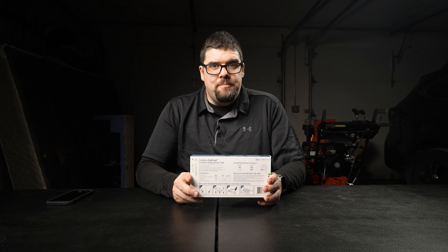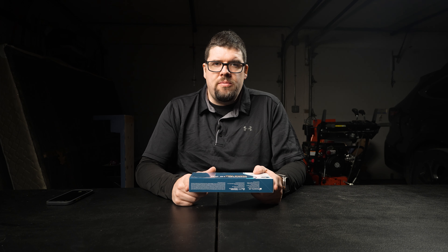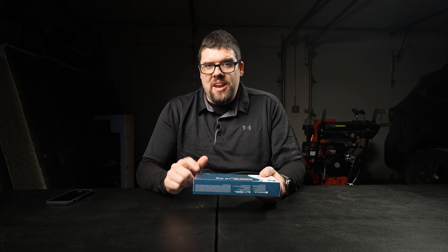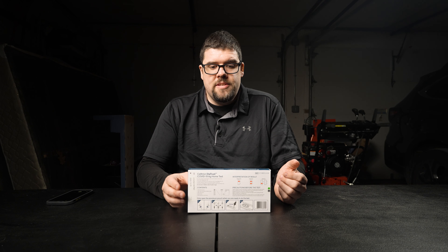It's a big box though — it takes up some space. So I'm going to open up this box, see what's inside, and then actually take the test myself. I want to let you know up front: I know I have COVID-19. So this should tell me that I have COVID-19 and I believe it will. Let's get this box open and see what we got.